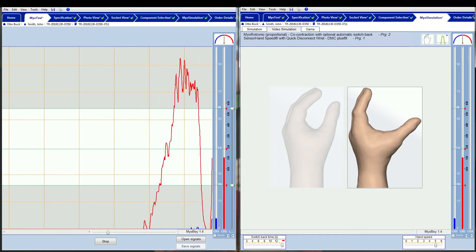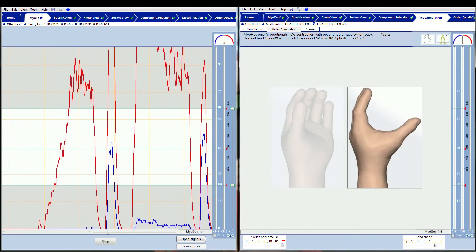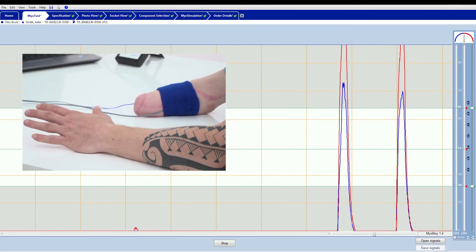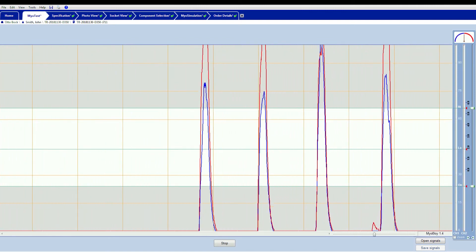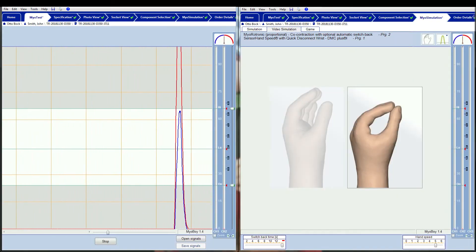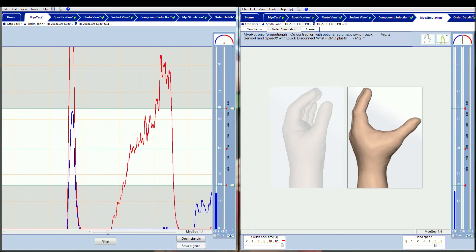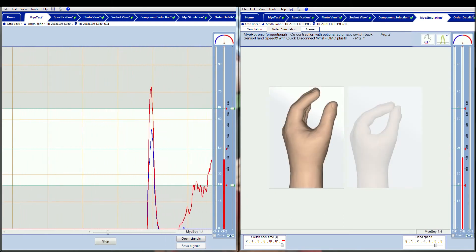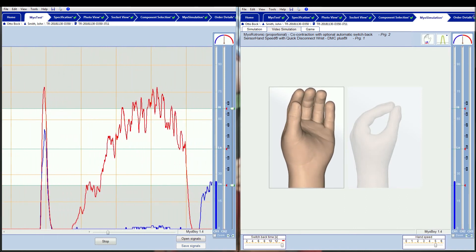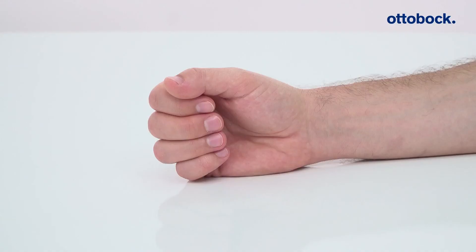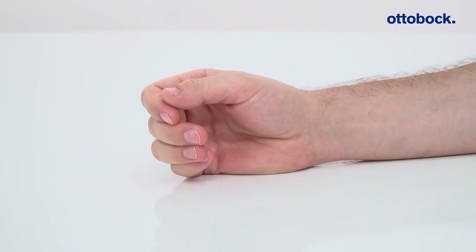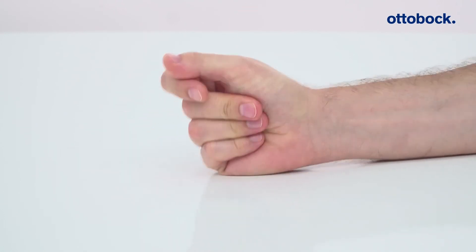The principle of co-contraction is to enable the use of hand function or rotation by an additional control signal. A co-contraction is a simultaneous short tension and then immediate relaxation of both muscle groups. When hand function is activated by a co-contraction, the hand opens with a red signal and closes with a blue signal. When rotation is activated by a co-contraction, the red signal rotates the hand outwards and the blue signal rotates the hand inwards. Phantom movements which may aid visualization of co-contraction are making a fist, spreading fingers outwards, and snapping fingers.